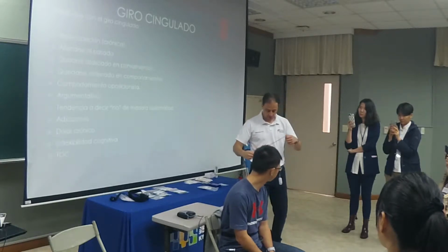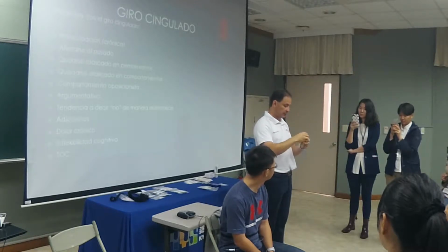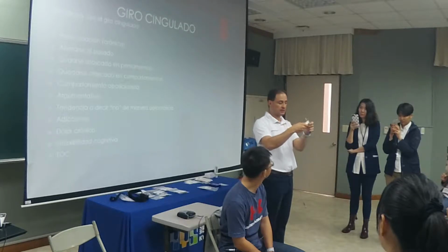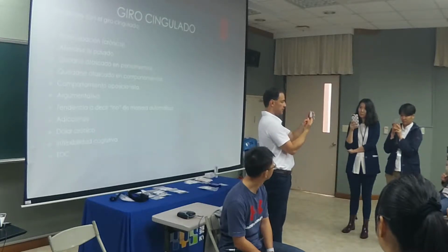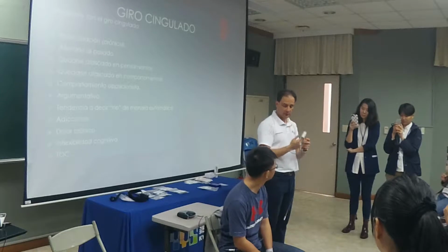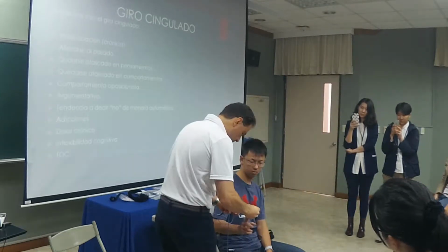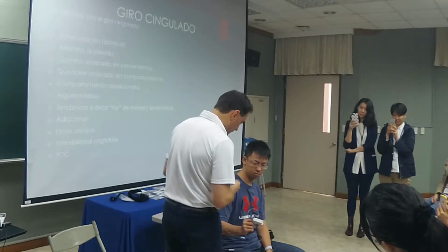Right hand. So it's going to go into the index finger. If you can see, you have the nail and finger, so you can follow it. So you can place it, and it looks like that. So you place it like this. It's got a drawing for you to follow. So please give your index finger and place this here. Does the pinch hurt anywhere? No? Okay, good.